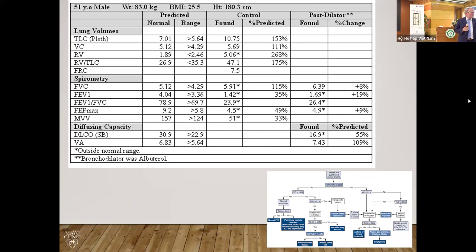Okay. So any reference values to classify the severities of air trapping and hyperinflation? No. This was done before GLI reference values were available. GLI reference values do include FRC and TLC, but nothing as far as classifying the other parameters. So up to now, we do not have any classification for it. And even the calculator is not calculating Z-scores yet for lung volumes.